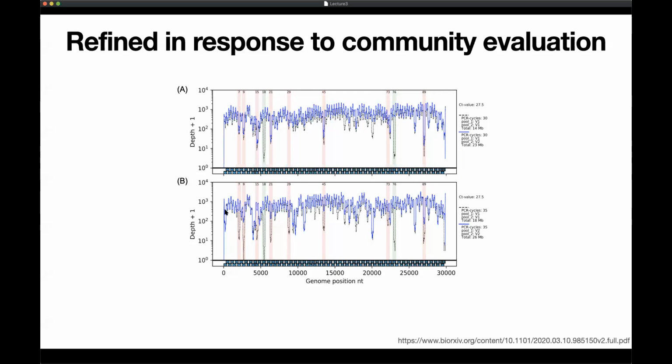And what's shown here is the coverage. What they've done is a whole sequencing protocol. They took a positive control sample with SARS-CoV-2, ran it through the experimental protocol, generated 100 amplicons, sequenced them all, and mapped them back into the genome to see which ones were successfully amplified or not. And the coverage, just to remind you, means that after they've done the sequencing, they were able to say that, for example, for this region, on average, between 100 and 1,000 reads covered this part of the genome. So all of these primer sets successfully amplified their amplicons.